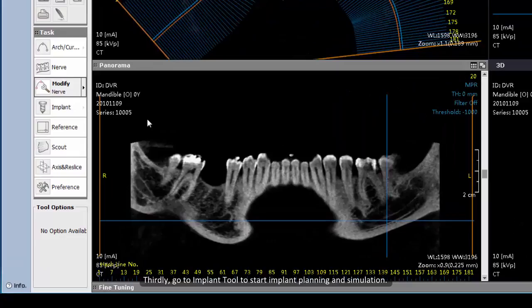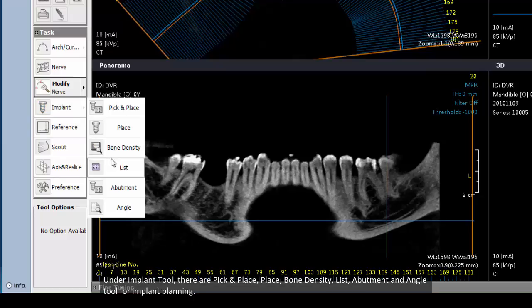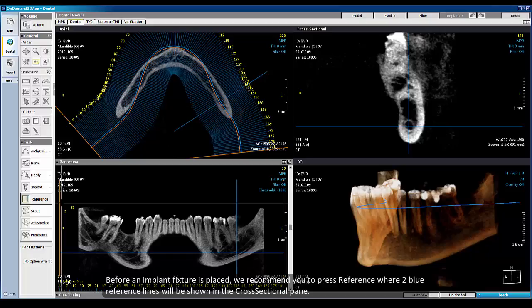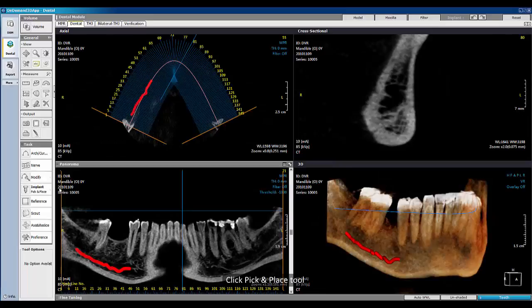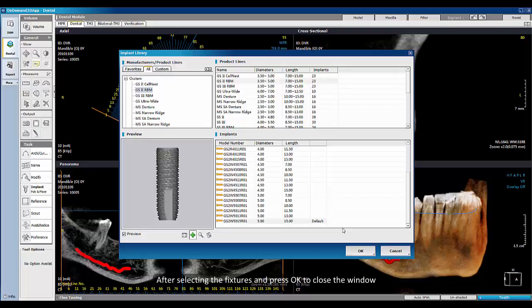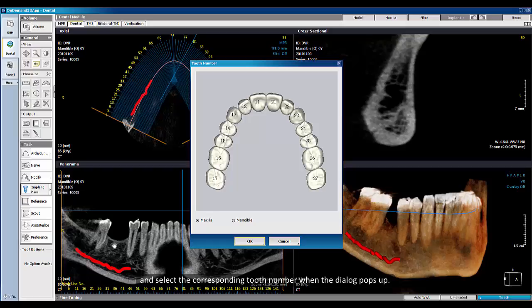Third, go to the Implant tool to start implant planning and simulation. Under the Implant tool, there are Pick and Place, Place, Bone Density, List, Abutment, and Angle tools for implant planning. Before placing an implant fixture, we recommend pressing Reference, where two blue reference lines will be shown in the cross-sectional pane. Then click the Pick and Place tool, and the implant library window will pop up, providing a manufacturer list, product lines, a preview window, and a section where individual implant models can be selected. After selecting the fixture, press OK to close the window. Next, click on the area where you want to place the virtual implant and select the corresponding tooth number when the dialog pops up.